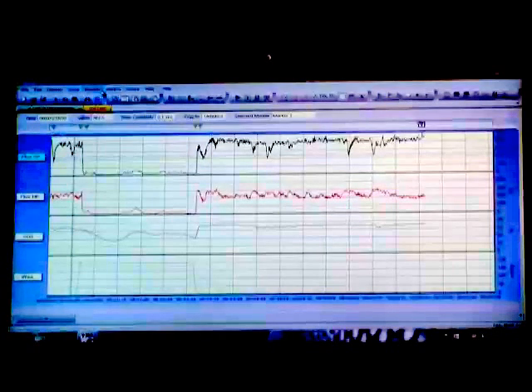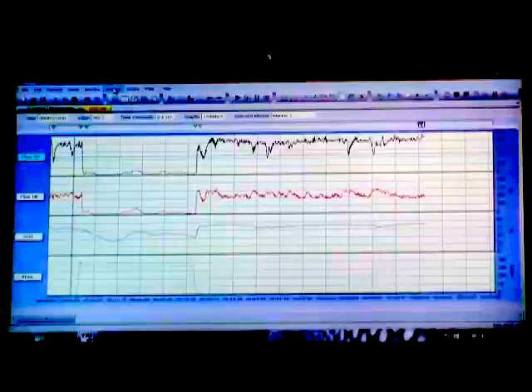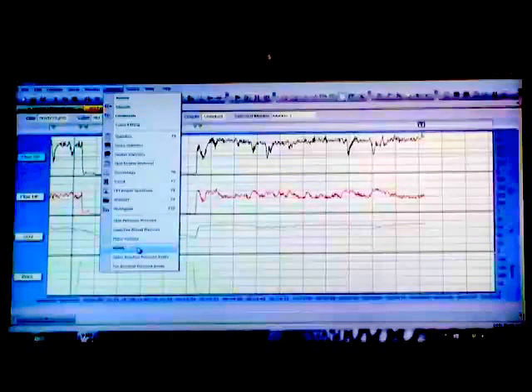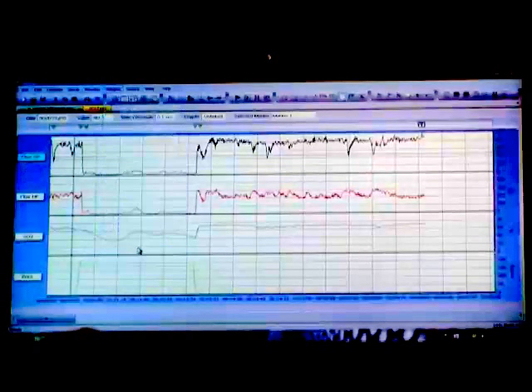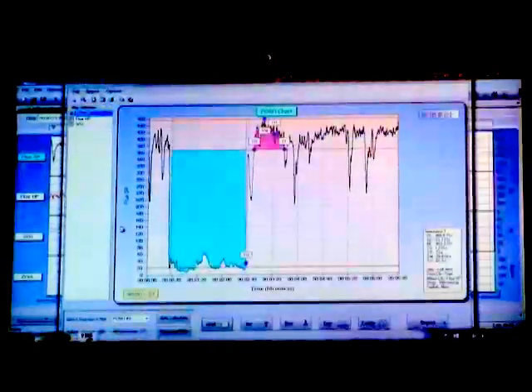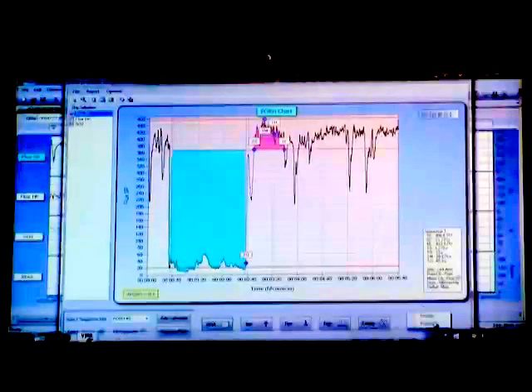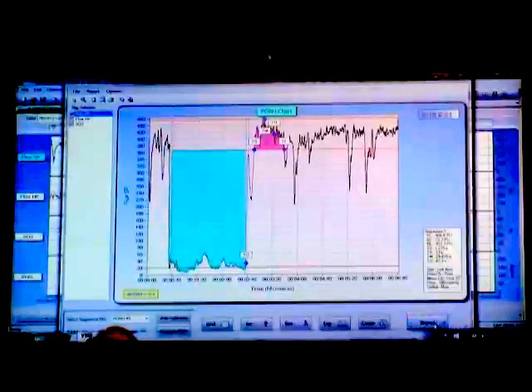we previously acquired. To analyse this data automatically, we go to the analysis menu item and then down to the PORH analysis feature. Single click on there and it draws up the analysed reactive hyperemia data. This analysed reactive hyperemia data can be saved as a patient report by clicking on the report button and then preview.